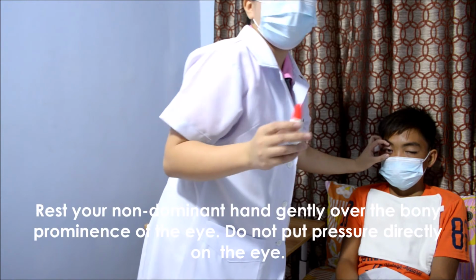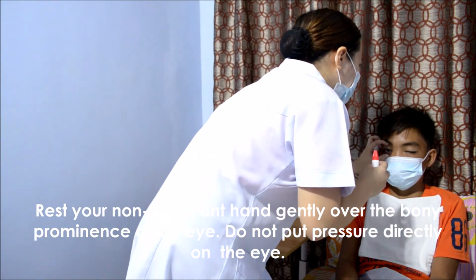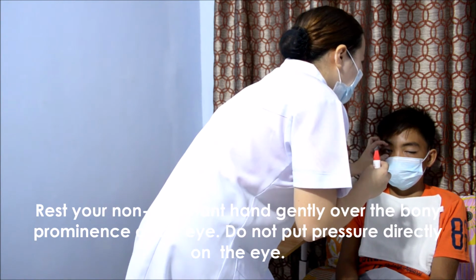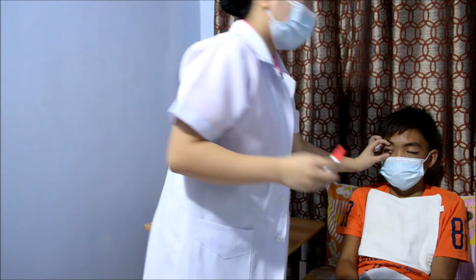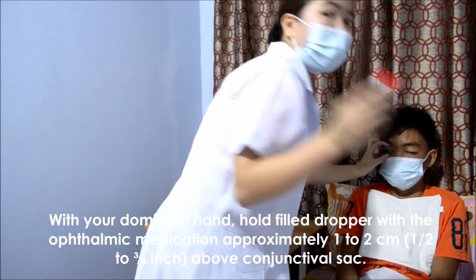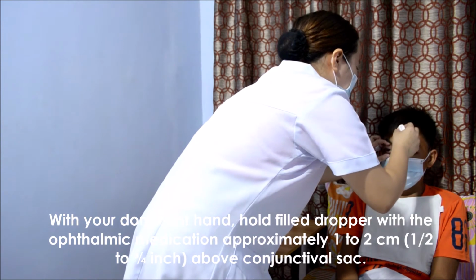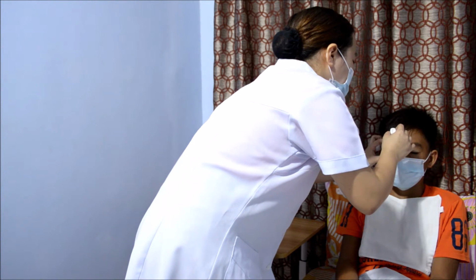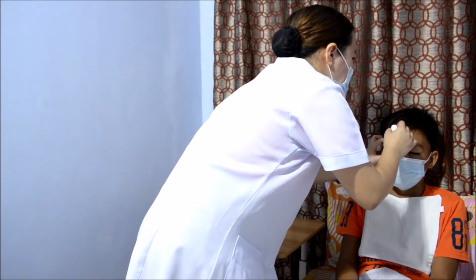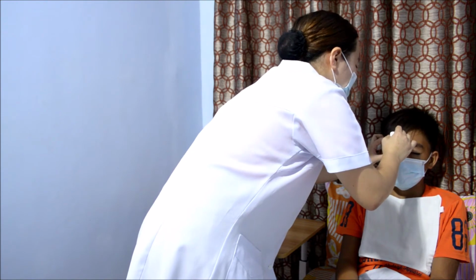Rest your non-dominant hand gently over the bony prominence and do not put pressure directly on the eye. Then with your dominant hand, hold the filled dropper with the ophthalmic medication approximately 1 to 2 centimeters, or 1/2 to 3/4 inch, above the conjunctival sac.